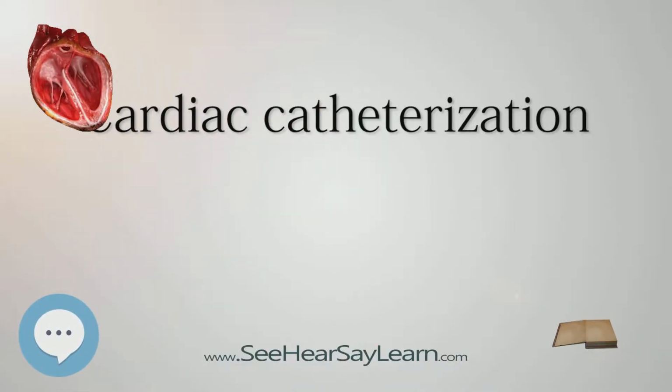Cardiac catheterization, heart cath, is the insertion of a catheter into a chamber or vessel of the heart. This is done both for diagnostic and interventional purposes. Subsets of this technique are mainly coronary catheterization, involving the catheterization of the coronary arteries, and catheterization of cardiac chambers and valves of the cardiac system.